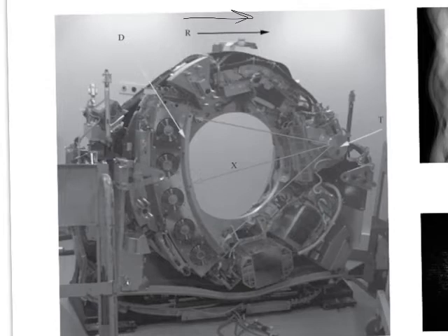And the only thing separating them is some flimsy material, something thinner than your desktop, basically, because we don't want a lot of stuff to get in the way of the x-rays. But I like this schematic because it's showing me a number of things. If you look here, I have a T right here. This is our x-ray tube. This is where we've embedded our x-ray tube. And it actually literally is just that x-ray tube stuck into the side of this thing, right?